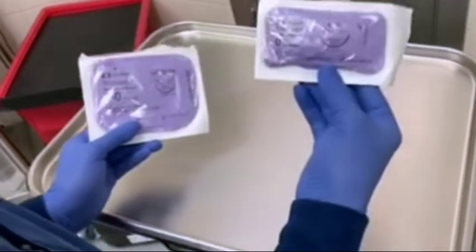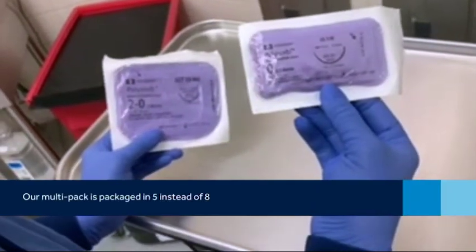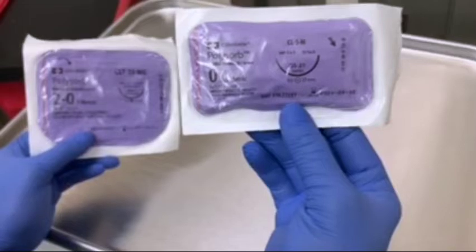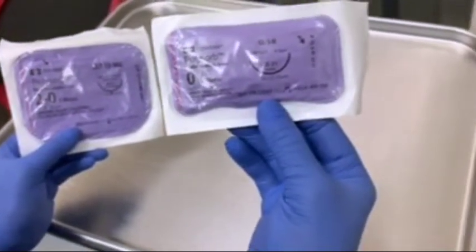All of our multi-packs do come in packs of five instead of eight, so that'll be a little different from what you're used to. Occasionally you'll see a multi-pack that's packaged in more of like a single pack, but again it'll have on the packaging — in the box itself in red — that it is a multi-pack.